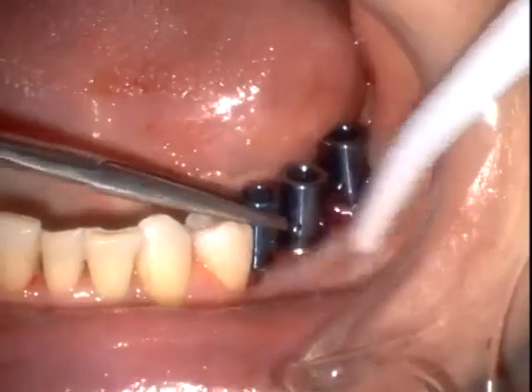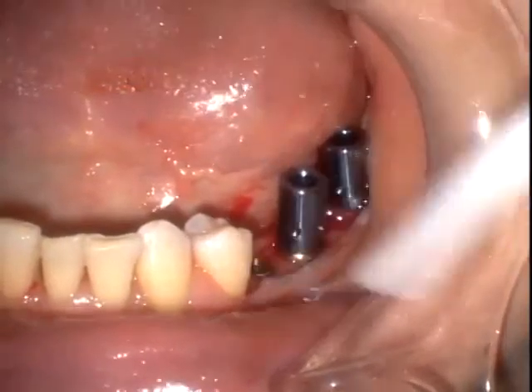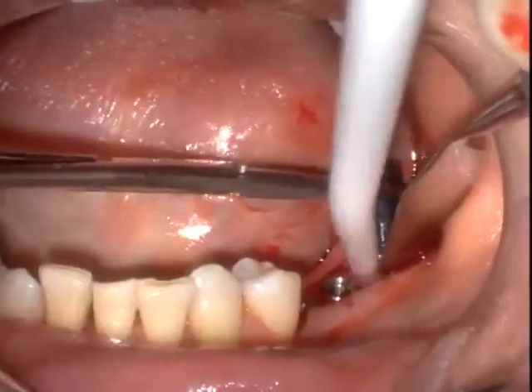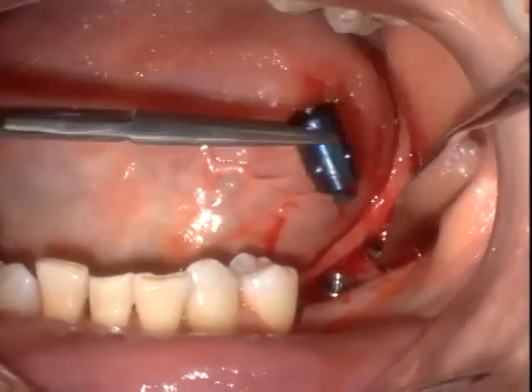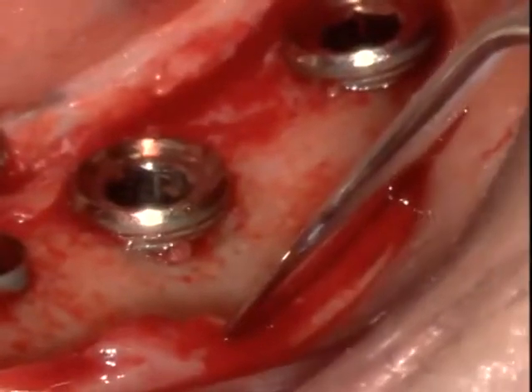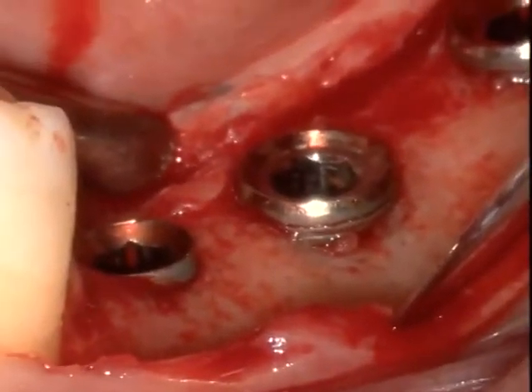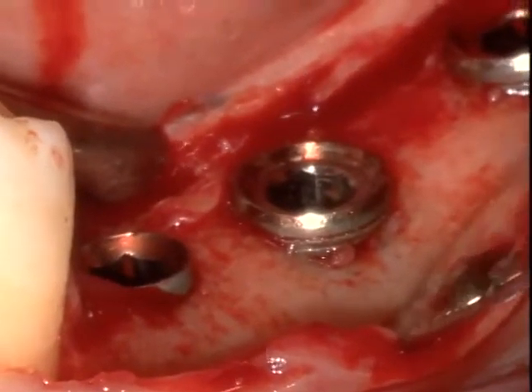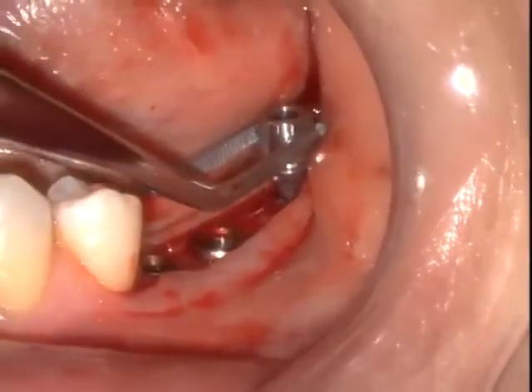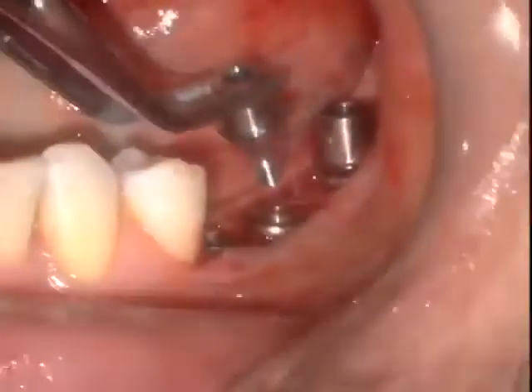Implant carriers are then removed from the tops of the implants, and again, I'm always pleasantly surprised by the significant accuracy in utilizing 3D imaging and cone beam in terms of our planning. You can see the slight dehiscence on the crestal aspect and buccal of the second and first molar implants, and we're going to utilize immediate placement of the final abutments.